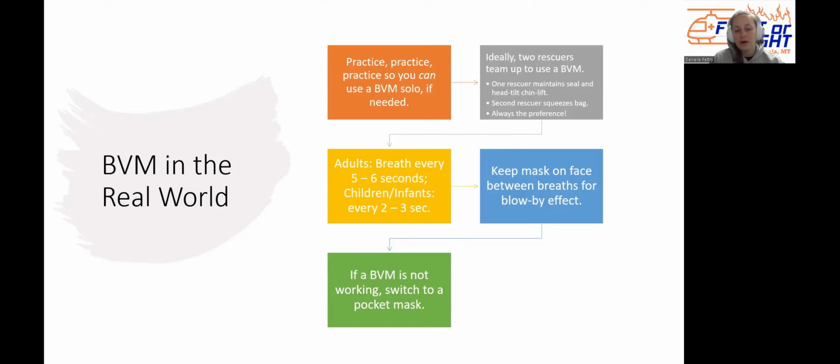Now, in the real world, if you only have one partner and there's only 2 of you and your partner's controlling bleeding and doing those kind of things, you may have to use a BVM by yourself. But if you're ever in a situation where there are more rescuers standing around, anytime you possibly can, you should have at least 2 rescuers using a BVM.